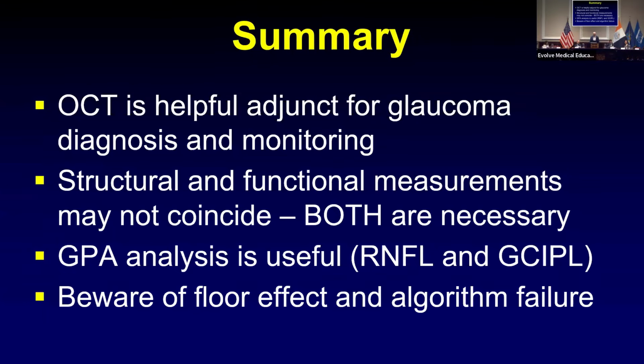So to summarize, OCT is an extremely helpful clinical tool in serving as an adjunct for both glaucoma diagnosis and monitoring. You need to follow both structure and functional changes over time. I find the guided progression analysis to be extremely useful in both the peripapillary optic nerve and the macular region, but one must be really careful to be aware of the potential for not being able to detect changes due to severe damage and the floor effect, as well as algorithm failure.